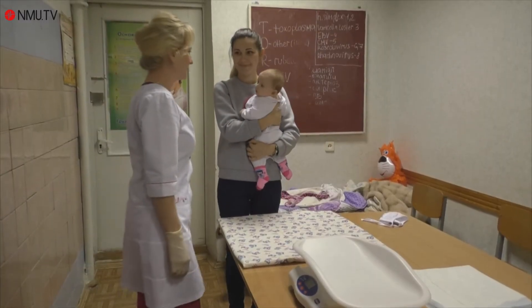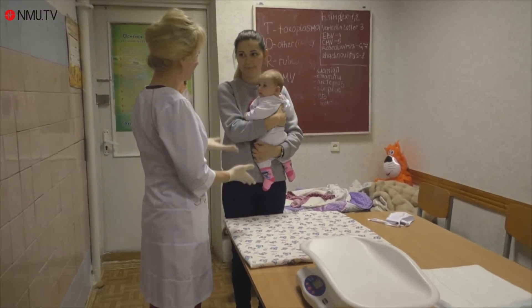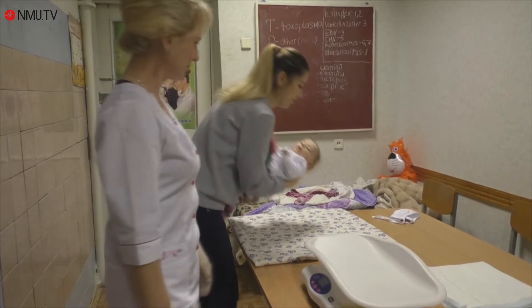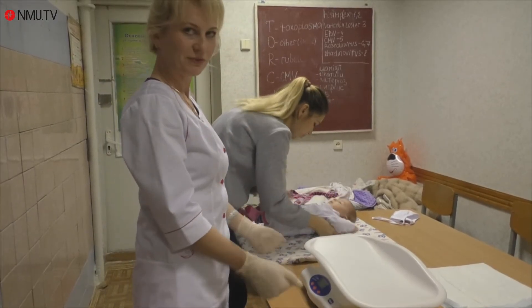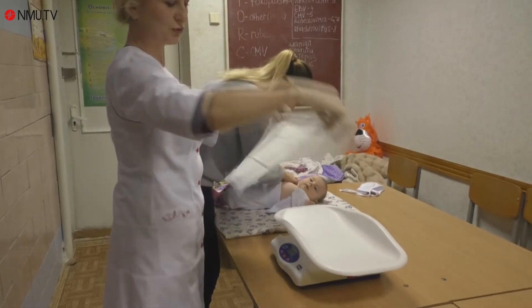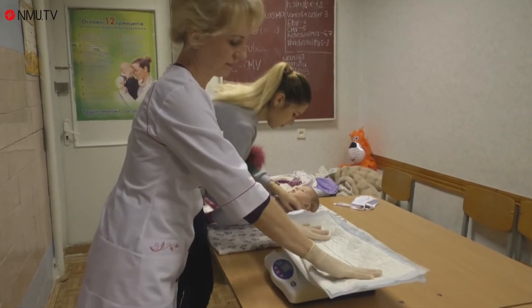The next step is to measure the child's body weight. For this, the baby should be undressed. For measurement, we use electronic scales. We put a blanket on the scale and turn it on.